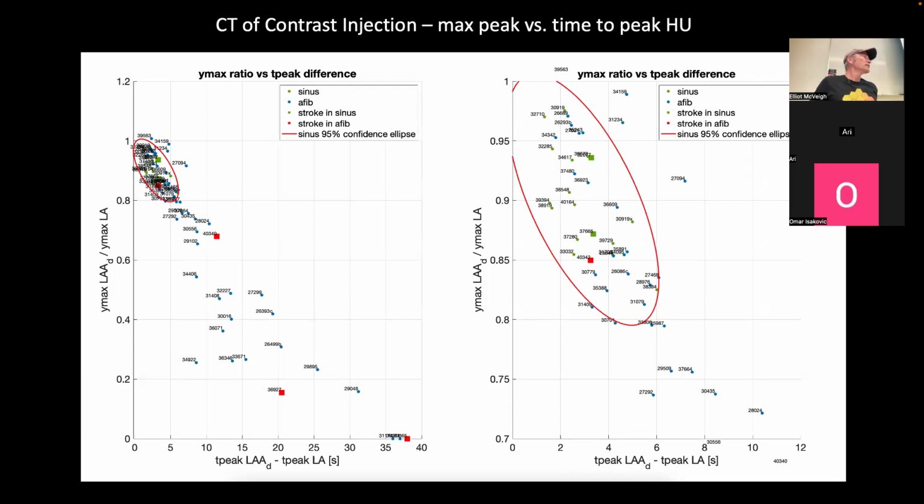Any questions about that? So the tricky bit about this scan is you have to take multiple pictures, right, with low dose. And so the question is, how many pictures do you actually need to take in order to classify a person as a high-risk person versus one of these lower-risk people?